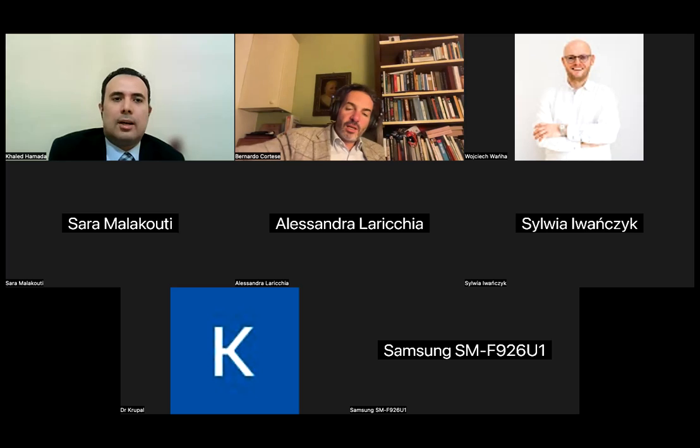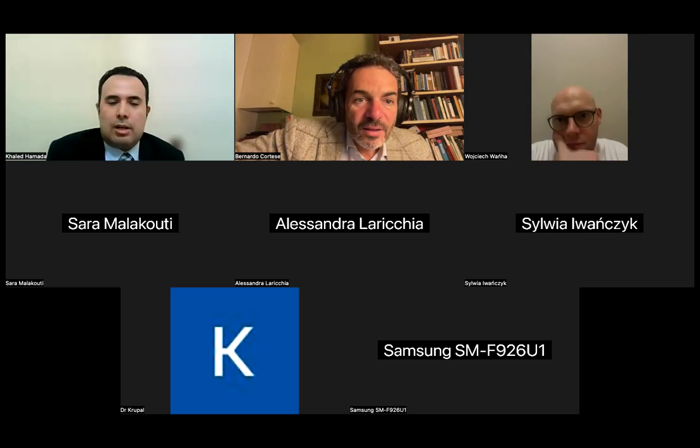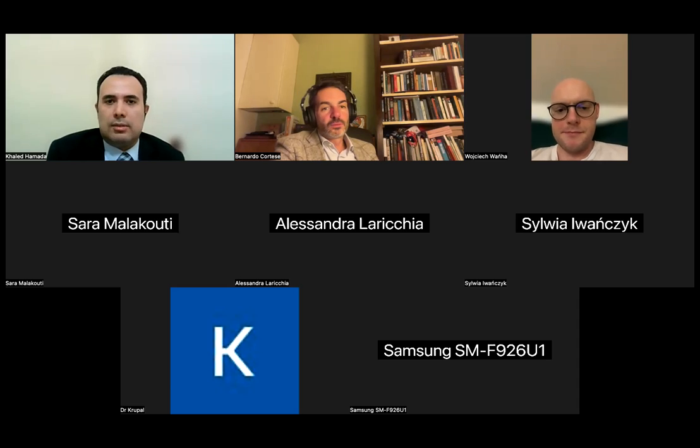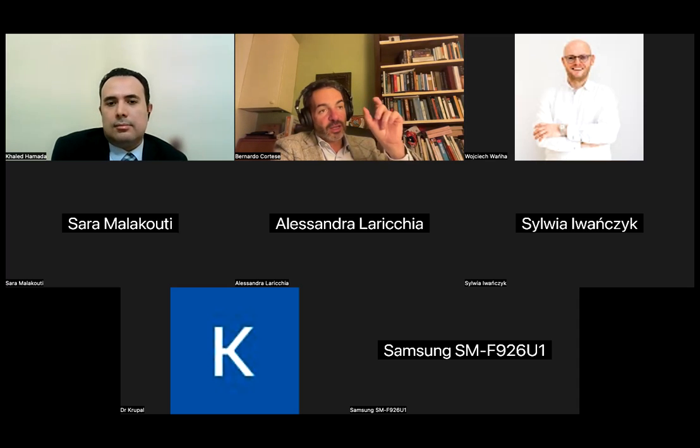I would like to see if people are still there listening to us. Excuse me, I have another technical question about the ostial left main for OCT. I read some papers that say they can use a guide extension for the assessment of the ostium. Do you do that? You can do it, but for the ostium, unless it is highly calcific and unless you have a calcific nodule, I don't think it is mandatory to use OCT or also IVUS. So if you have a focal stenosis of the ostium, and I repeat it is not highly calcific, you can go with a straight angioplasty.